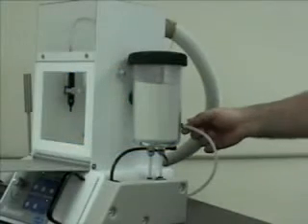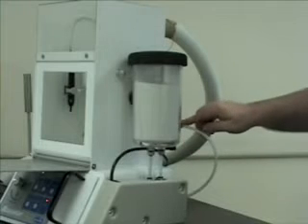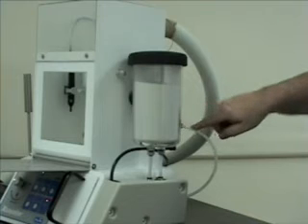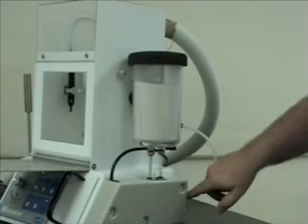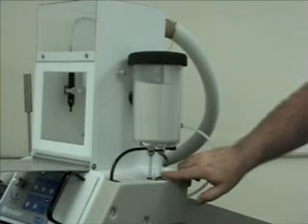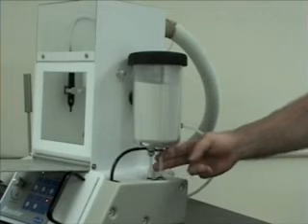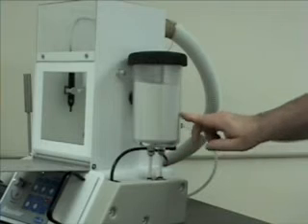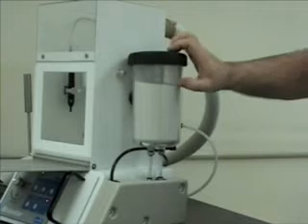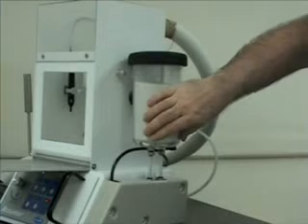Okay, the next thing we're going to talk about is just a quick discussion of how the unit operates. The air comes in from the air regulator through this on-off valve, and it comes down this tube and on into the inside of this cover. It then takes a right turn and comes upward through this tube, which you'll notice is always empty, and it should remain empty. It goes up through the metal standpipe, which actually goes through the beads and comes into this void up here above the beads and pushes down on the beads to push them out.